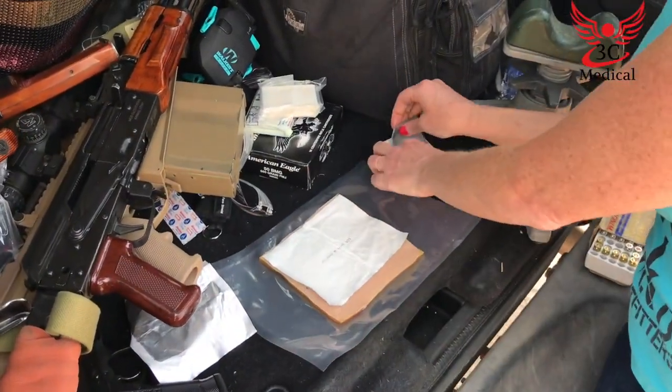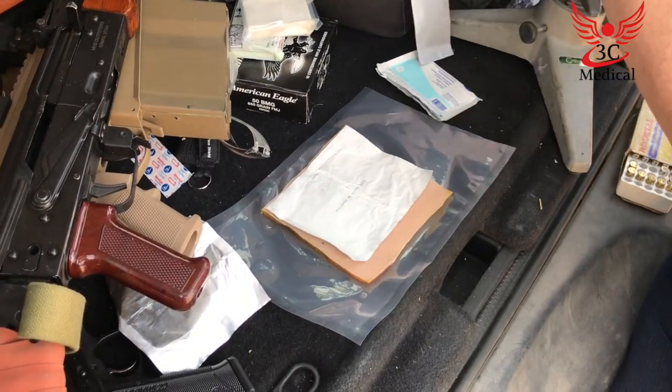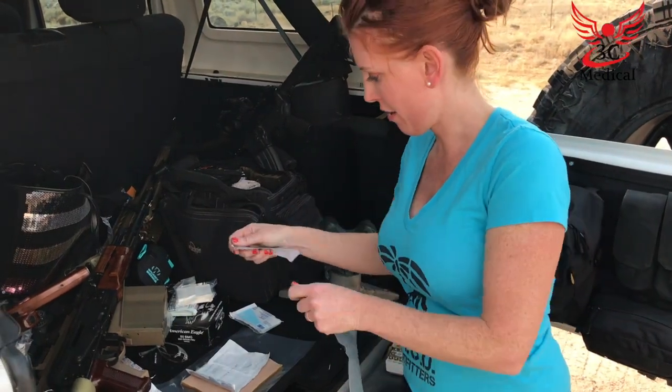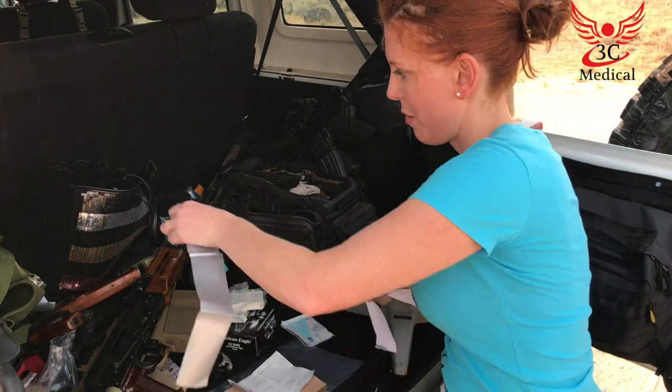You want to tape three sides so that way the air that is stuck inside can still get out. This tape is just easily terrible. We need three strips — tape three sides.